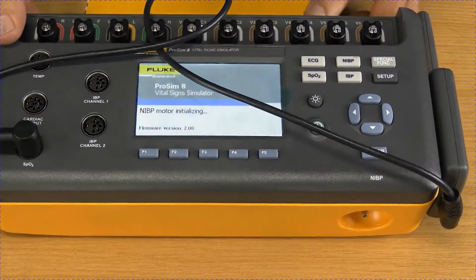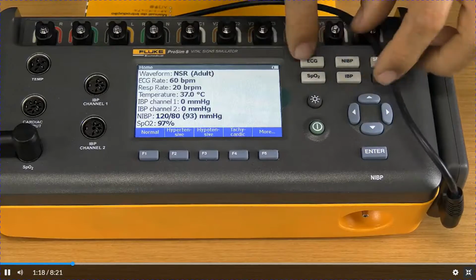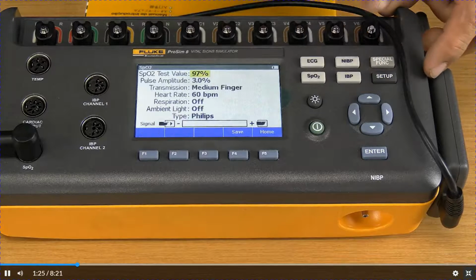and wait for the unit to boot up. When the machine comes up, it comes up in a normal patient simulator where it simulates ECG, NIBP, SpO2, all those parameters for you. But what I want to do now is concentrate on the SpO2 only. You see the 4 function buttons here: ECG, NIBP, SpO2, and IBP. We're going to go to SpO2.